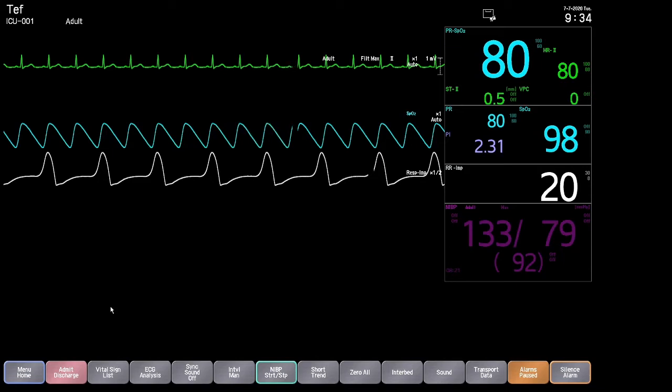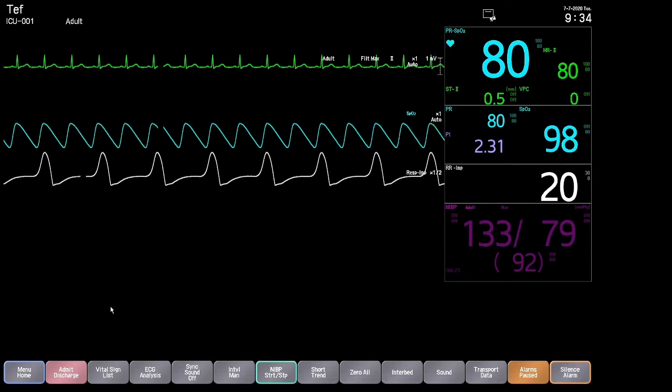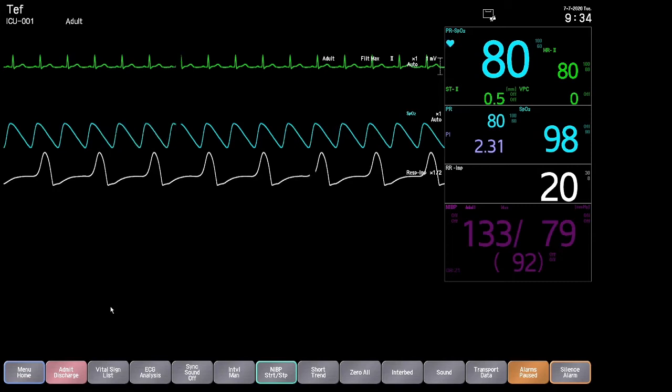The SpO2 cable is labeled SpO2 in blue and corresponds to the blue port on the brick. The patient connection end will have the same connection to the SAT probe as in current use. If a second SpO2 reading is needed, a smart cord with a yellow end is used. This will be reviewed in the advanced SpO2 monitoring video if it applies to your clinical area.